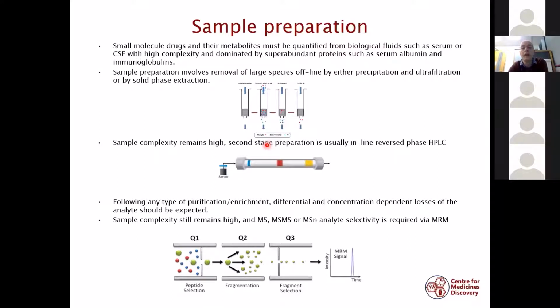So the way to do that, there are different ways. It can either be done by precipitation and ultrafiltration, or it may be done by solid phase extraction. In our lab, we do it by solid phase extraction. You can do this in relatively high throughput.